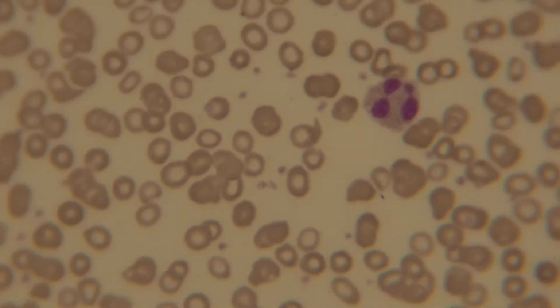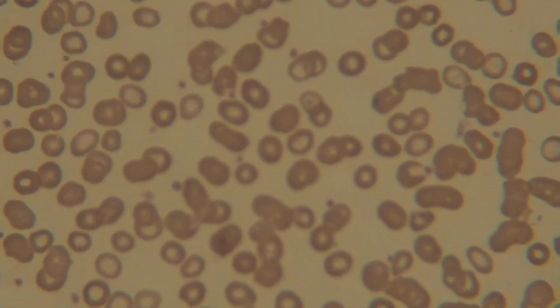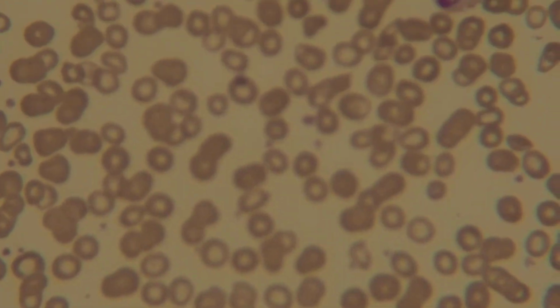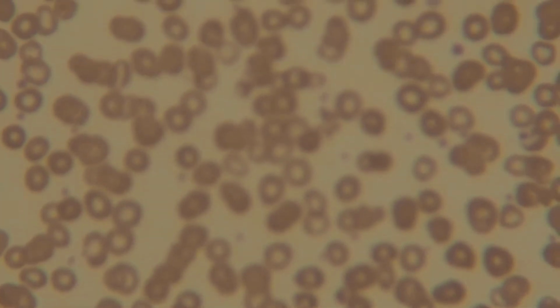Neutrophil. Lymphocyte. Neutrophil. Neutrophil, lymphocyte.